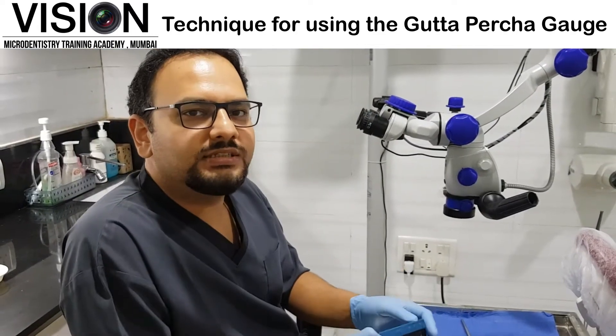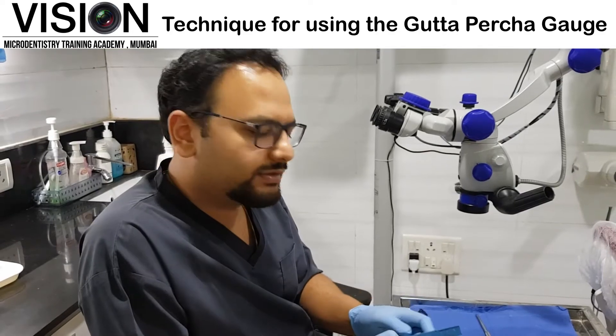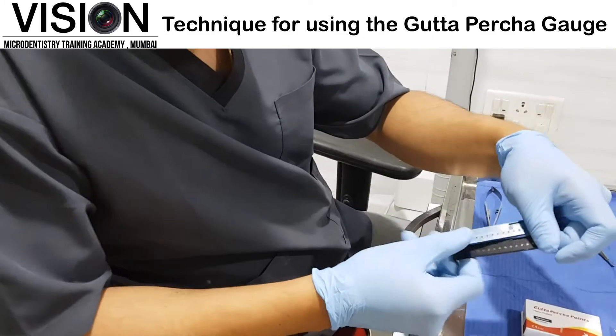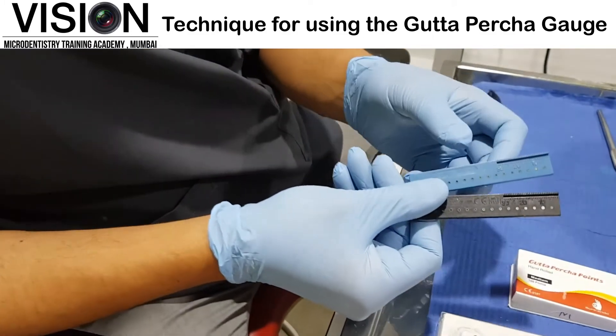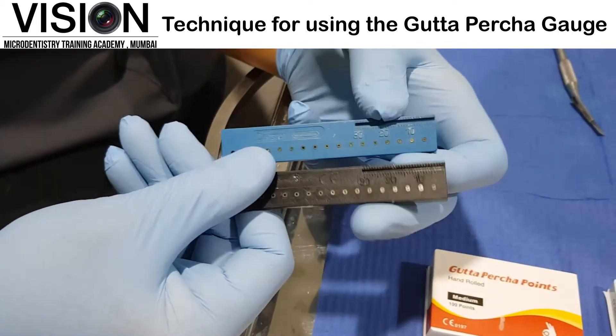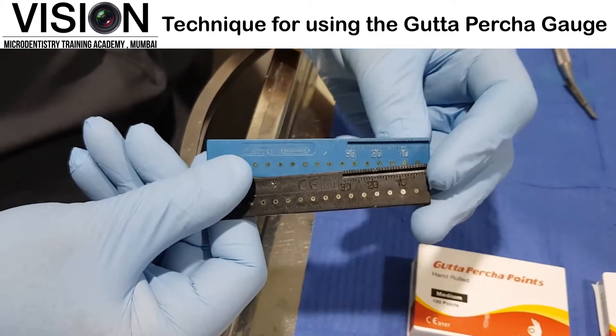To customize these GP points, we have something known as a GP gauge, which is available from different manufacturers. I have two versions of this GP gauge from Dentsply. As you can see, both of them look pretty much similar and they are just different in color.